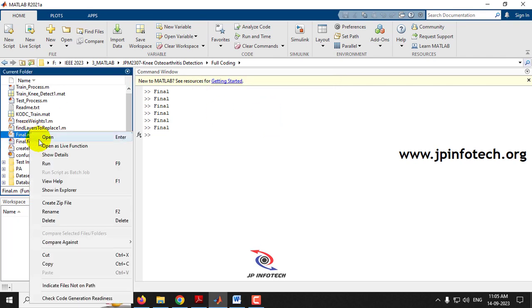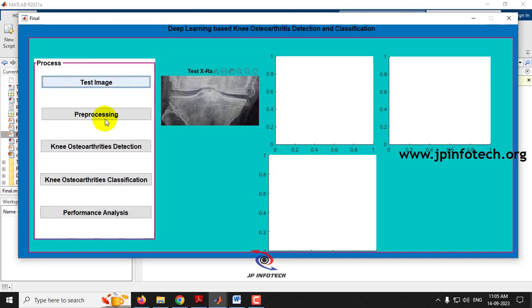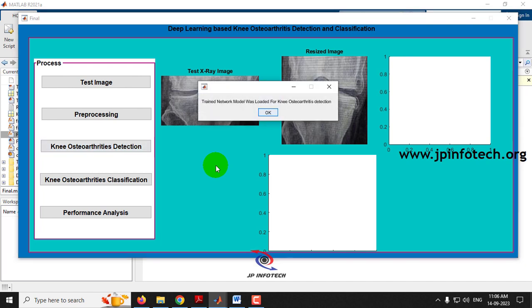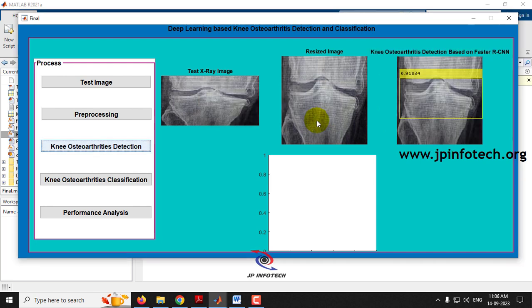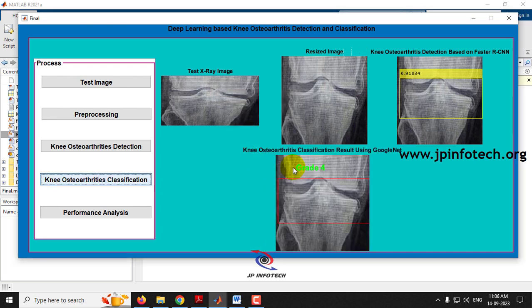Finally, let me show the grade 4 case from the dataset. Select an image from grade 4, give pre-processing, go for the detection part. Now you can see the detected result with the predicted score. Going to classification, it has predicted correctly as grade 4 using GoogleNet.